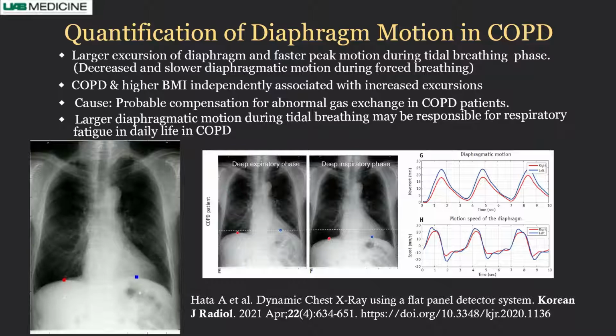So what is the clinical implication? Larger diaphragmatic motion occurs during resting to compensate for hypoxia due to less gas ventilation exchange in the rest of the COPD lung. And because the diaphragm is working more, it leads to respiratory fatigue during day-to-day life. And if you tell these patients to walk a little bit or do some exercise, they get worse because now their diaphragms are not even moving that much, so they get short of breath very quickly. So this is an objective way of looking at why the COPD symptoms are occurring in these patients.